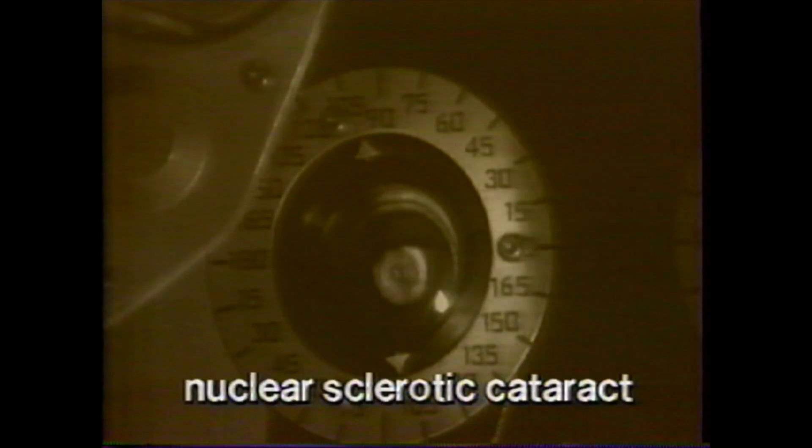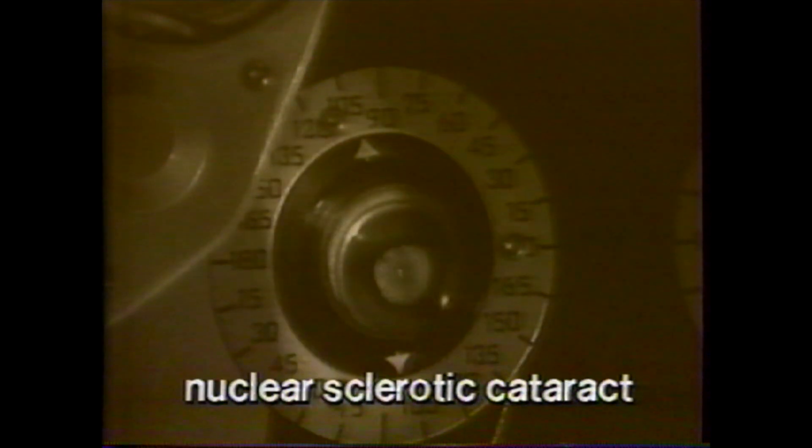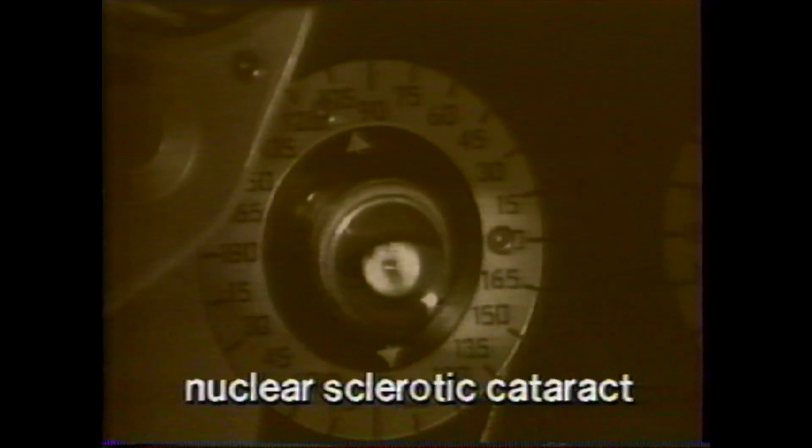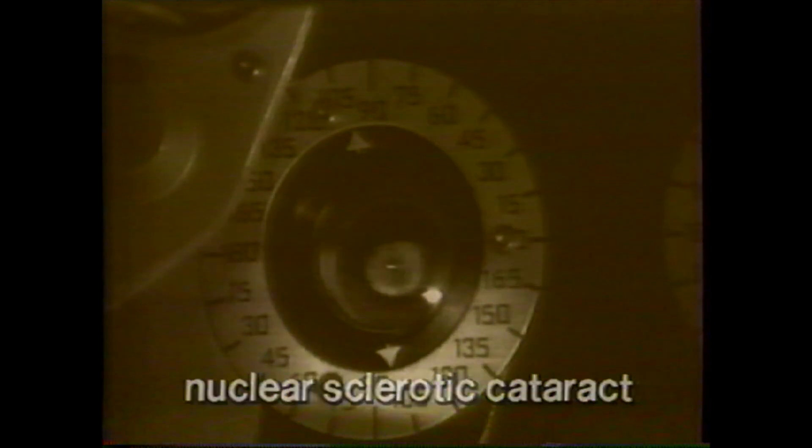Spherical aberration is also present with nuclear sclerotic cataracts, but here the center portion of the pupil is myopic. The central reflex shows against movement and the periphery shows with movement.